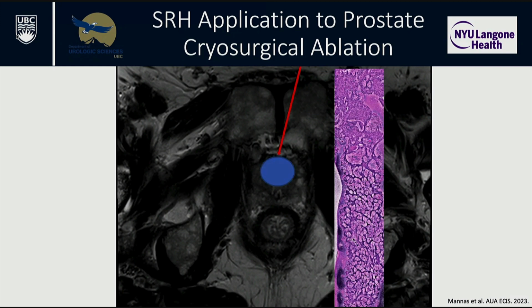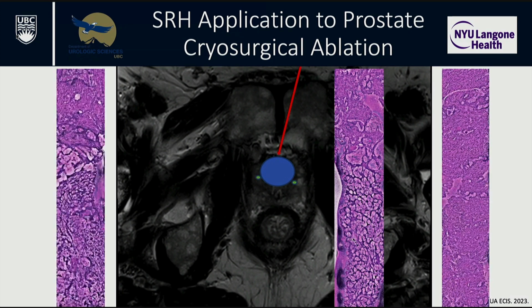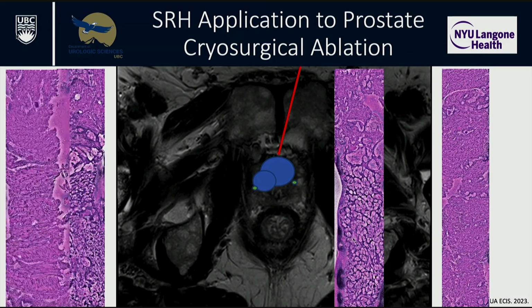We then decided to just take 1 biopsy lateral to the treatment zone. So obviously, there's a significant margin that wasn't sampled, but we just wanted to see what happened. So we sampled it. This is benign, so that's great. Sampled this one, should be benign, more cancer. That gave us the ability to put in another probe, perform a freeze, and then assess it again, which then we had what was a negative biopsy. We concluded the study there. So, this is a possible application in real time. This didn't increase operative times. It was done while the patient was asleep and the procedure was going.